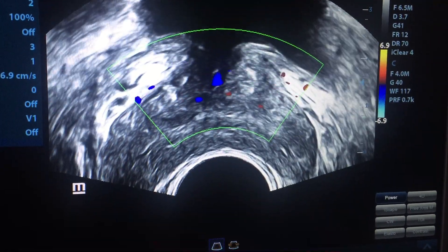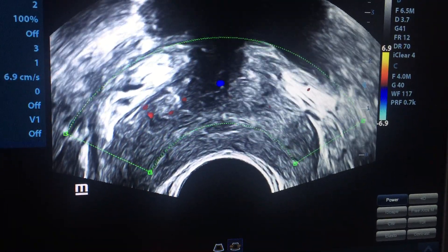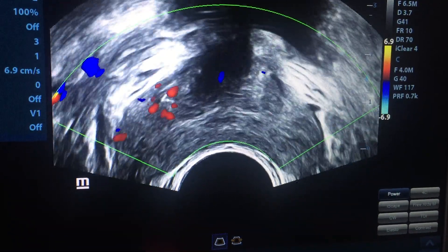You can apply color Doppler here to see some vascularity in this region.